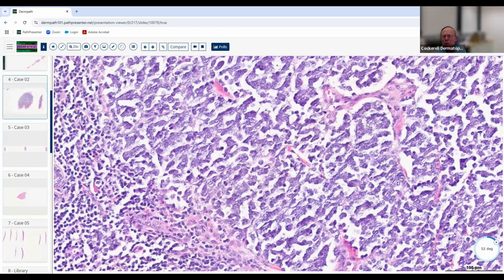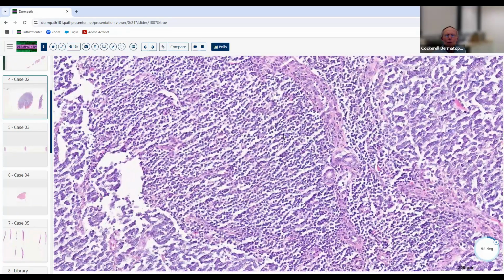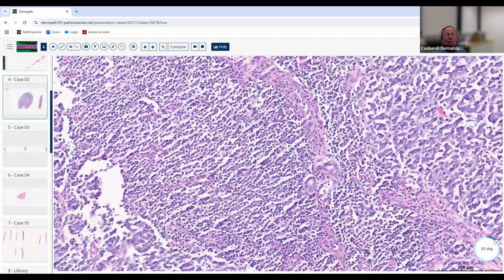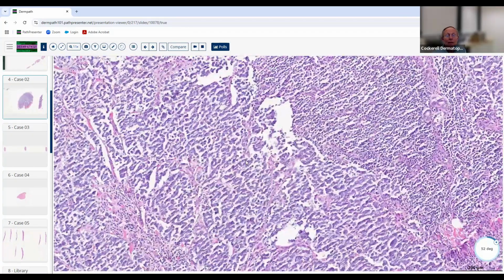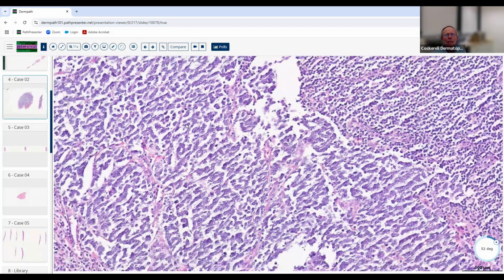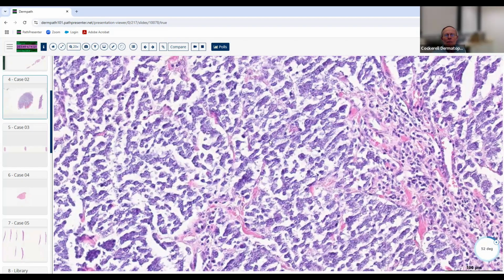You can see that these cells are degenerating. They've got this irregular, smudged chromatin pattern. Here you've got some inflammatory infiltrate inside the lesion, and some of these small cells actually may be part of the neoplastic process itself, interestingly enough. And then over here, you see some of the cells arranged in these little cords and strands. And notice this indistinct, smudgy chromatin pattern. That's pretty characteristic of neuroendocrine differentiation when we see this. And so if we were to see something like this, we would be quite concerned about Merkel cell carcinoma, maybe a metastatic small cell carcinoma.